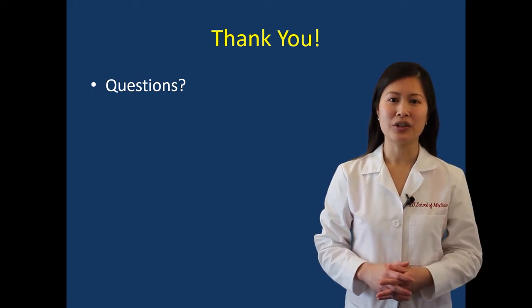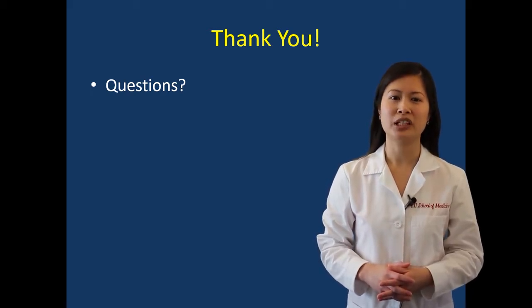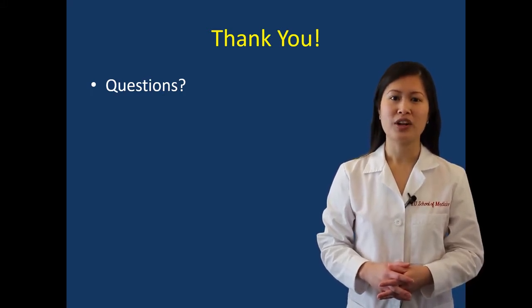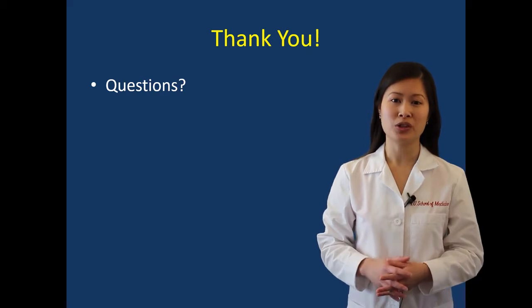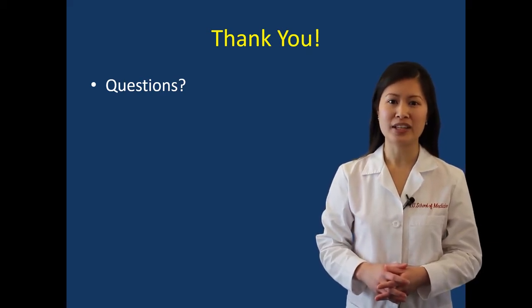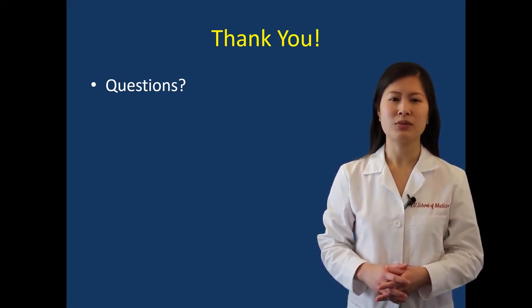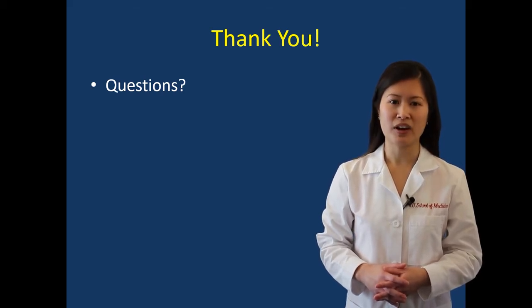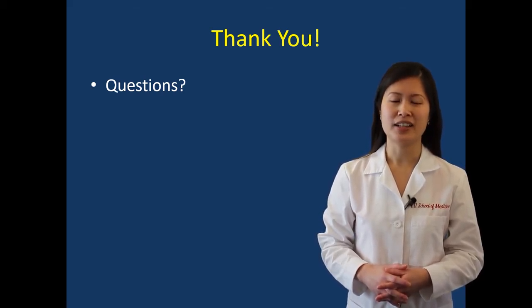This concludes our overview of thyroid imaging, information regarding radioactive iodine therapy, and post-treatment guidelines. We hope this has been helpful. One of our nuclear medicine technologists will be with you shortly. The technologist will ask you questions regarding some of the things we've already discussed in this video. Please answer to the best of your ability and feel free to ask any questions. If you would like to speak with one of our physicians, please let the technologist know.